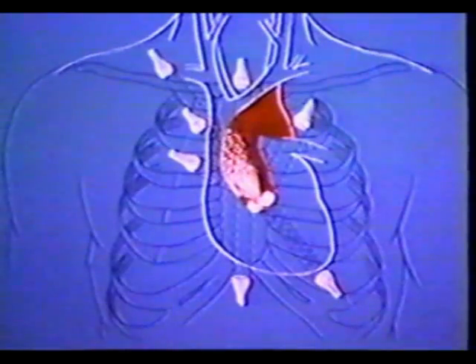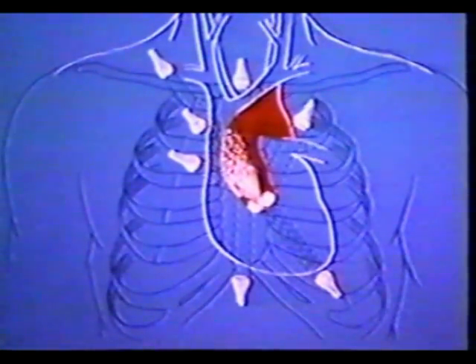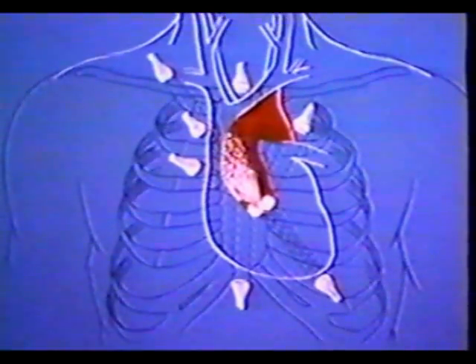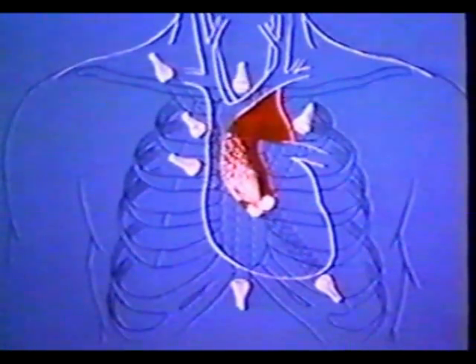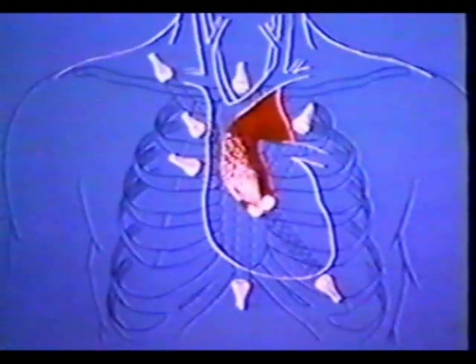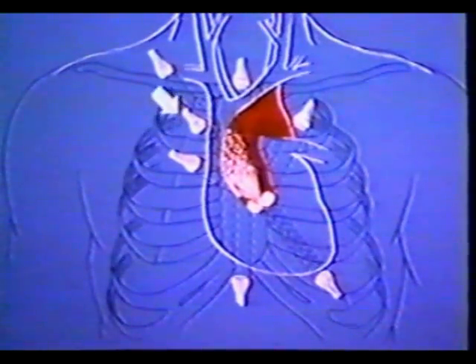It is critical that the gradient information which we report to the clinician is derived from the maximum velocity obtainable by Doppler. This will occur only when we have oriented our Doppler beam so as to minimize the angle theta. In order to accomplish this, we must inspect the valve from multiple transducer locations. In most cases, the maximum velocity will be obtained with the transducer either in an apical or right parasternal position.